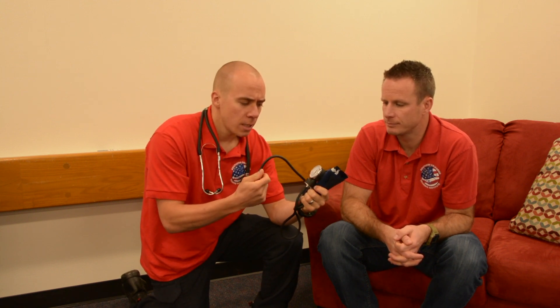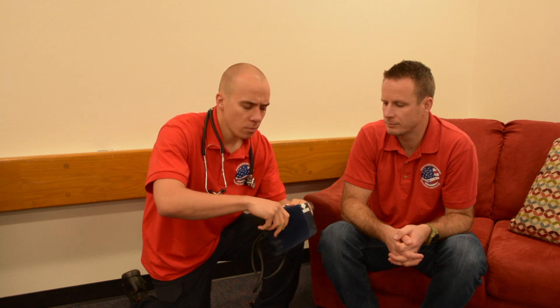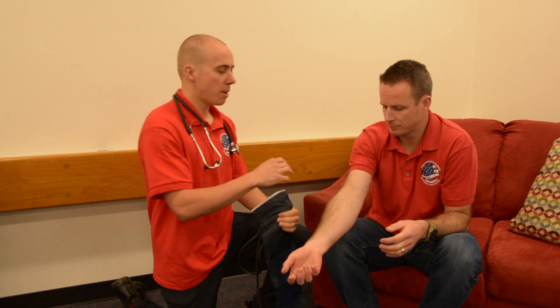When you're putting the blood pressure cuff on a patient, you want to make sure that you control that person's arm. Sometimes patients are going to be moving around, talking, not paying attention — they don't know you're taking their blood pressure. So tell the person, 'Ma'am, sir, I'm going to be taking a blood pressure, please keep your arm still.' If they're still moving or they're unresponsive, take that arm and lock it out so they can't move. Take control of that person.